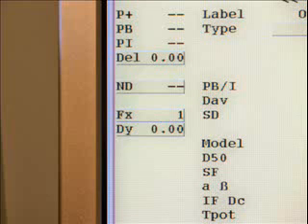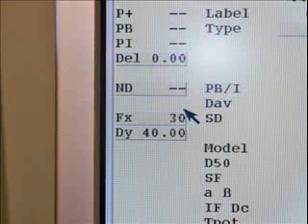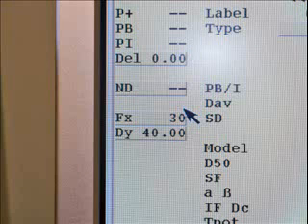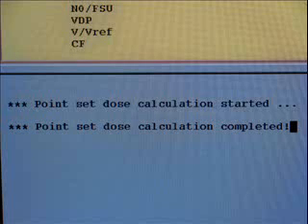The tool is capable of accounting for fractionation and cell repopulation. Enter the number of treatment fractions and the time span between the first and the last fraction. When the tool is initially displayed, the treatment planning system automatically samples a statistically sufficient number of dose points in each region of interest and calculates dose in these points.